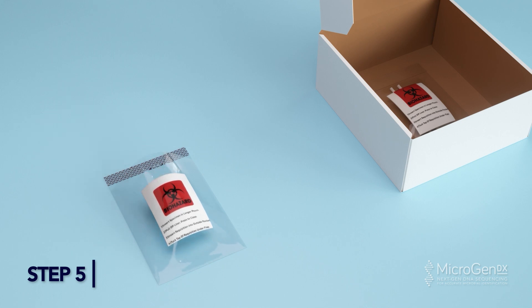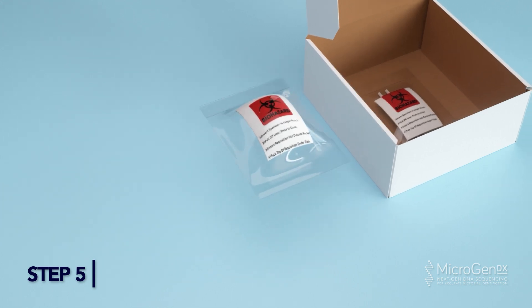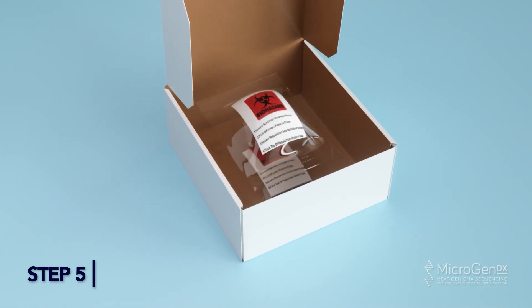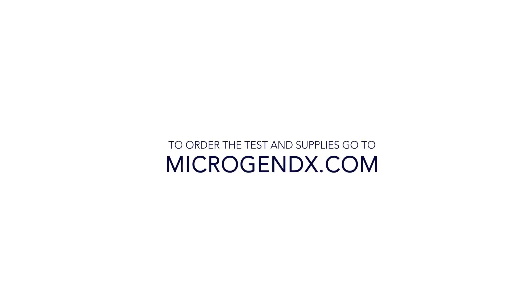Peel off the adhesive strip and press to seal the bag. Place the sealed BioBag into the MicroGenDX prepaid shipping box. Once both samples are in the box, close the lid and ship out according to your facility protocol. Alternatively, take to the nearest FedEx Dropbox. To order the test and supplies, go to MicroGenDX.com.